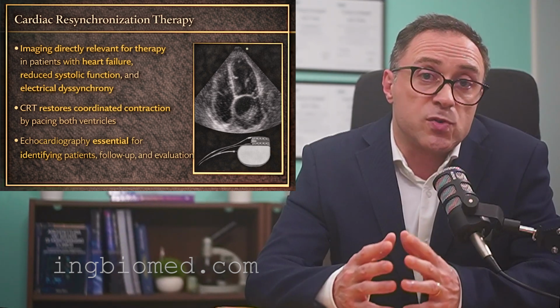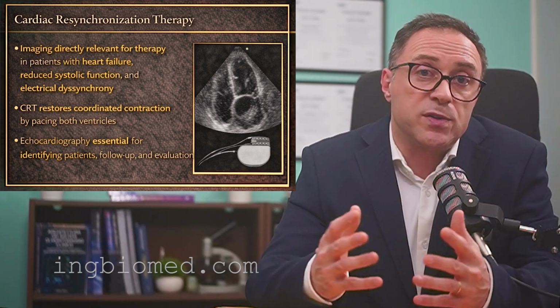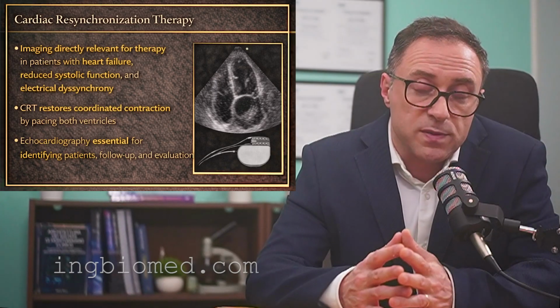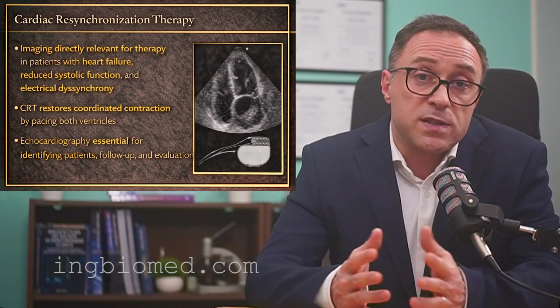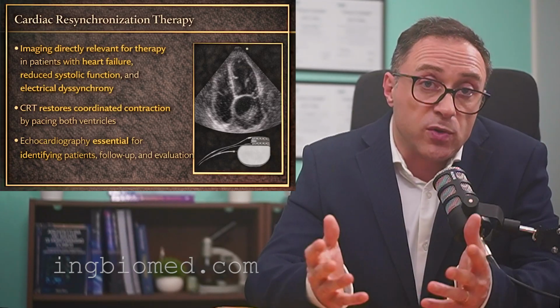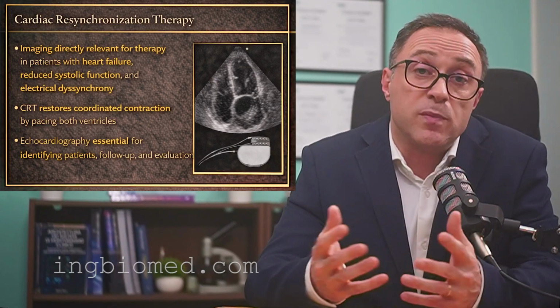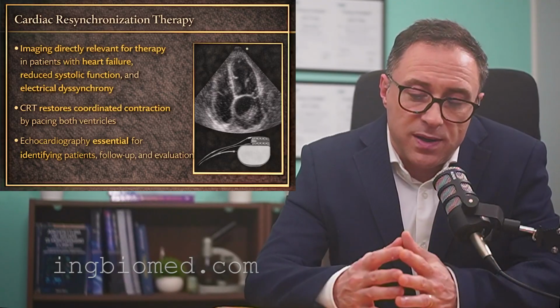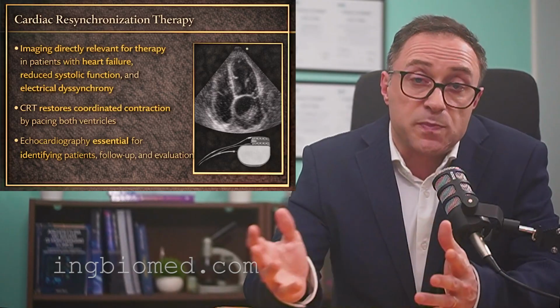The idea is to restore a coordinated contraction by pacing both ventricles. In this context, echocardiography is essential not only to identify suitable patients, but also to support follow-up and evaluate the response to therapy.